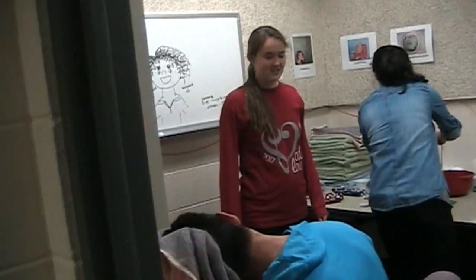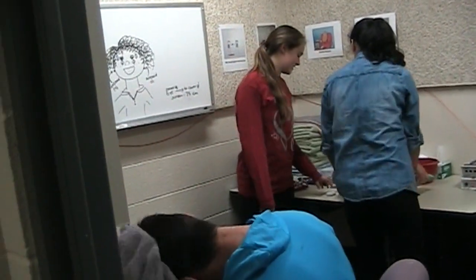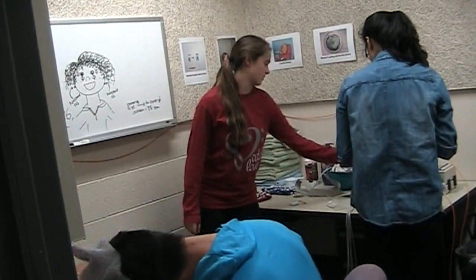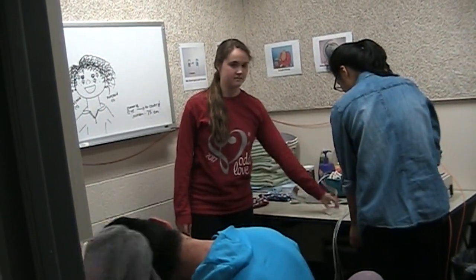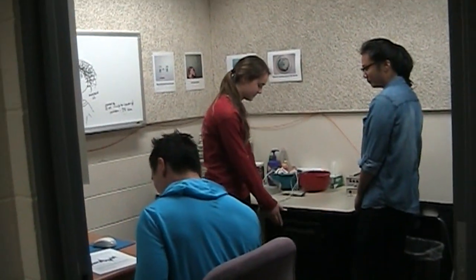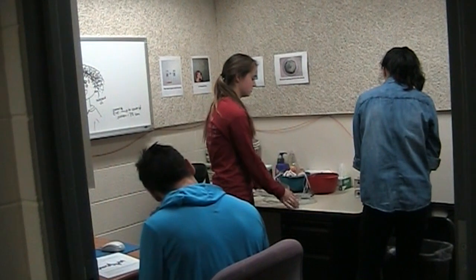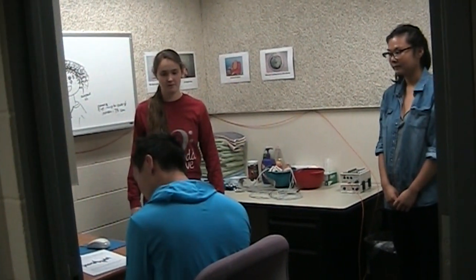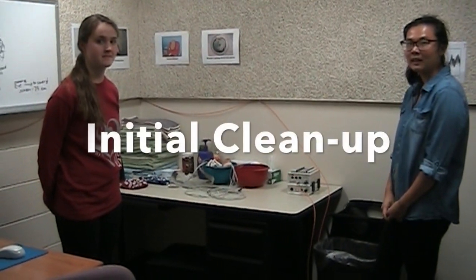There's a lot of gel. No, you're good. So then we just put... Is there gel on my face? Probably a little bit. Then I'm going to follow you.